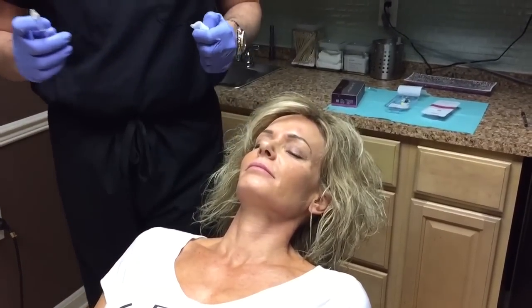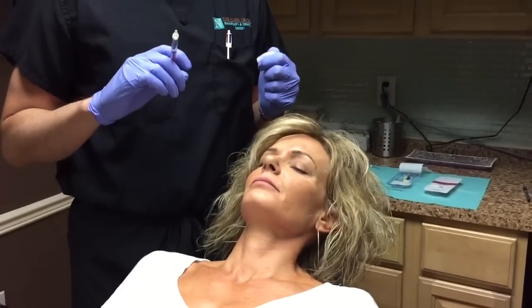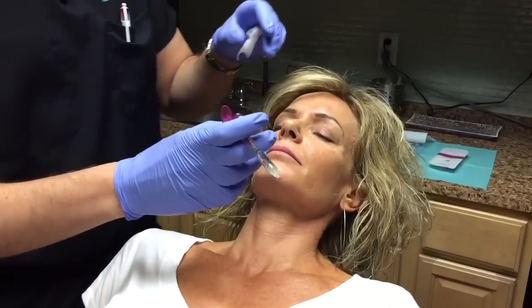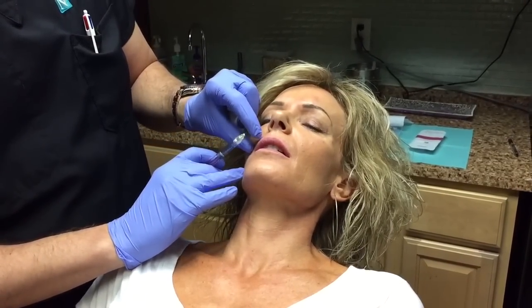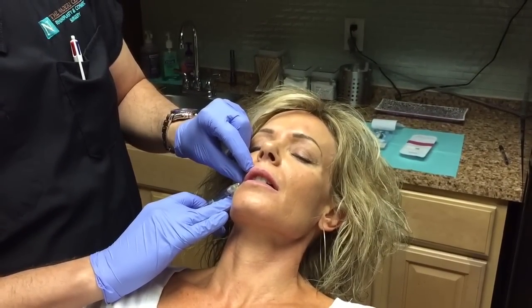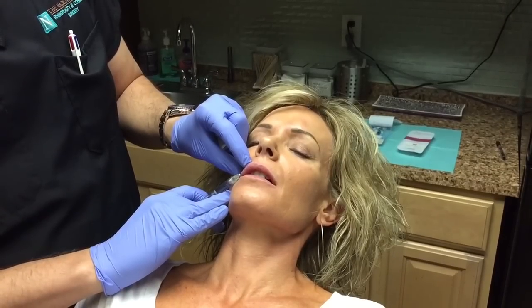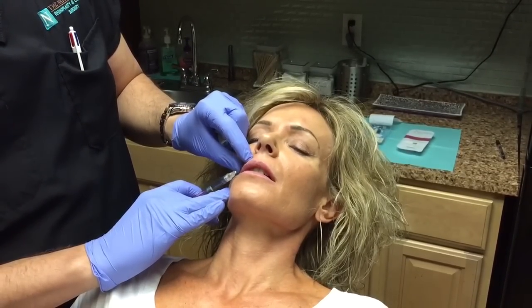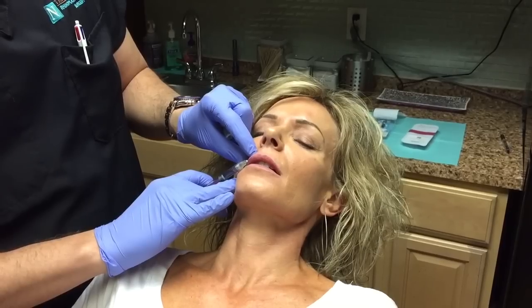Okay, so you've seen the injections that we've had with the long needle, and this is the short needle technique. When the lips are thinner, you have to go from multiple different directions. So I have the patient laying back, lips are open just a little bit. Start from the corner. Again, it's important to be really gentle. I've seen some real stabbing actions, jabbing actions into the lips. It scares patients, scares viewers, scares the children. You can be very gentle.